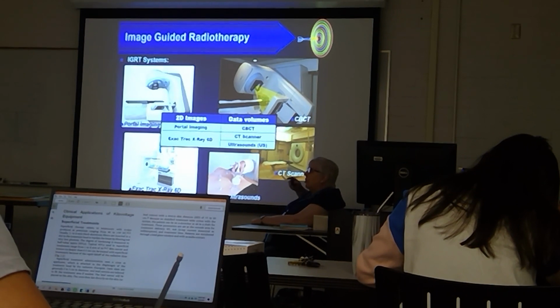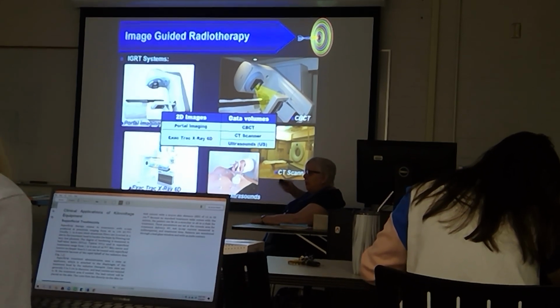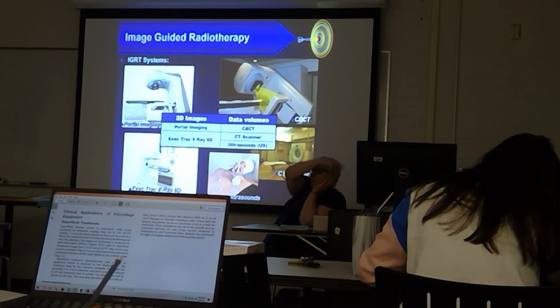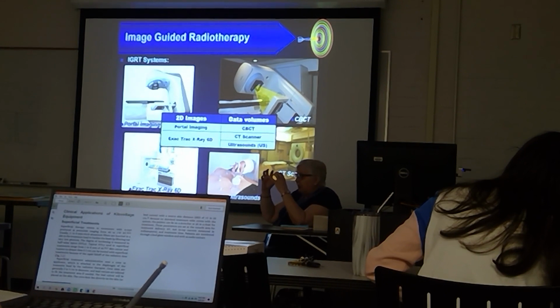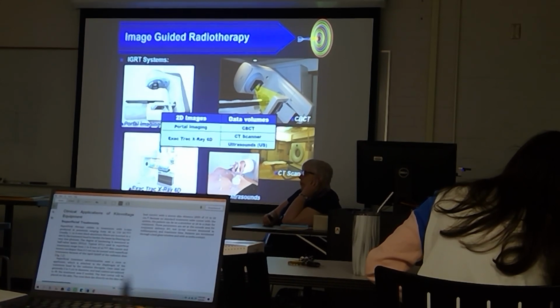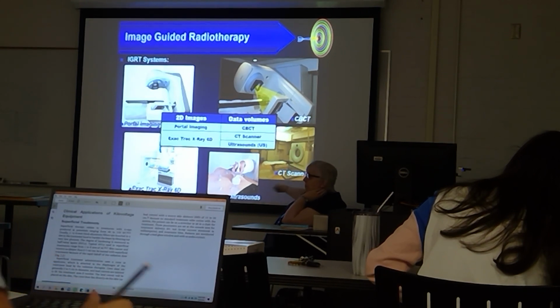The second lot of software gives you cone beam CT. It converts all of these KV images, a complete scan all the way around, and converts all of these images to a CT slice. So when they're saying DRR, the digitally reconstructed radiographs, is that from the individual KV images? This is from the CT.